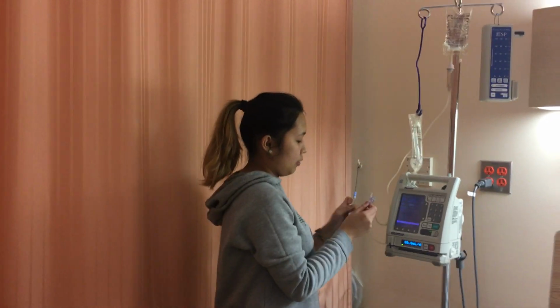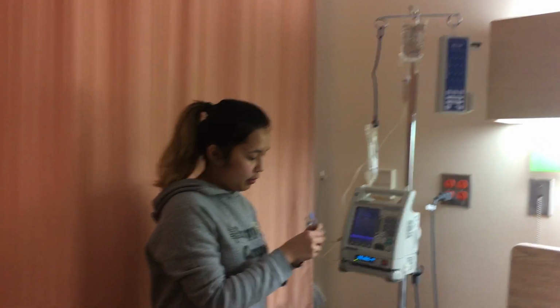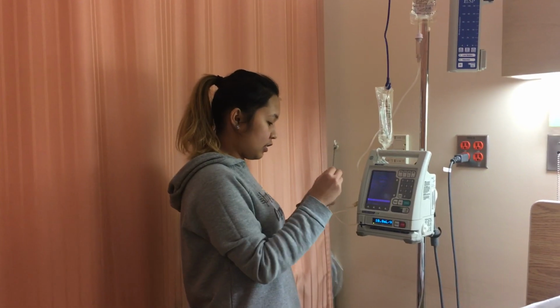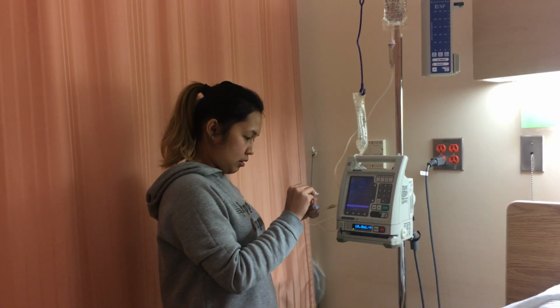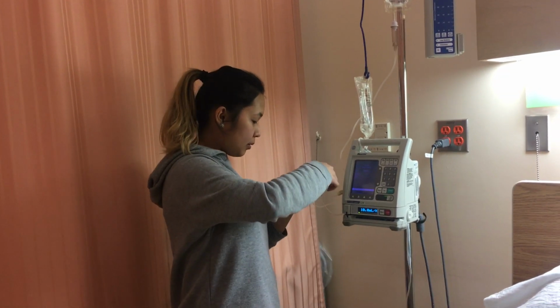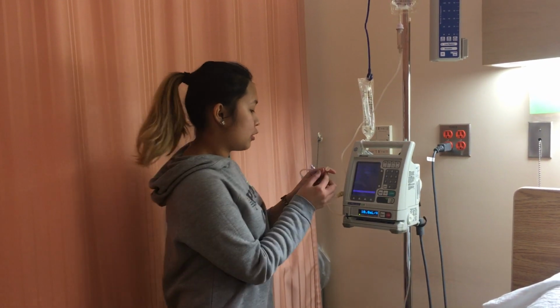So I am going to swab the port first. I think that this one was for 30 seconds. Let it dry for 15. And while I connect it, I'm going to keep in mind to keep these two ends sterile.